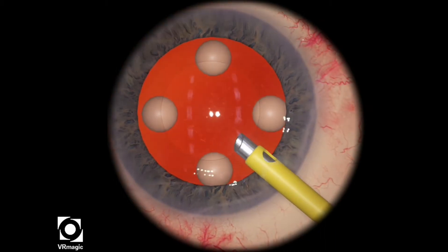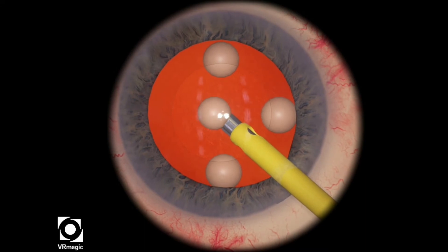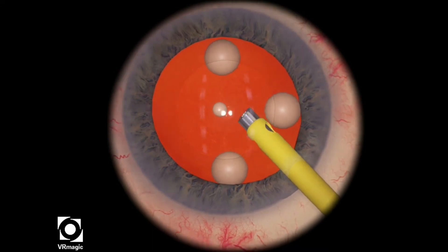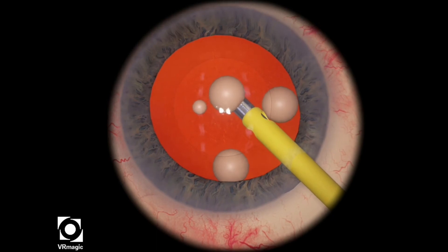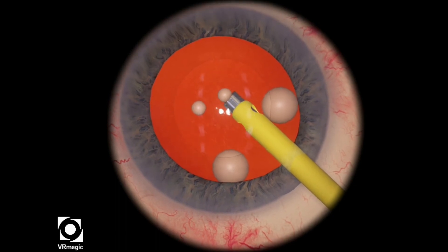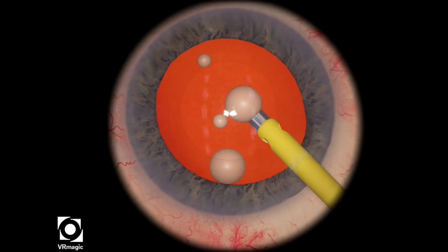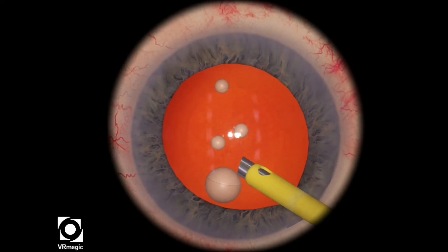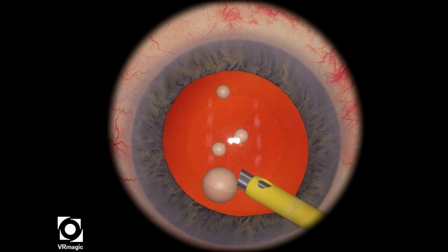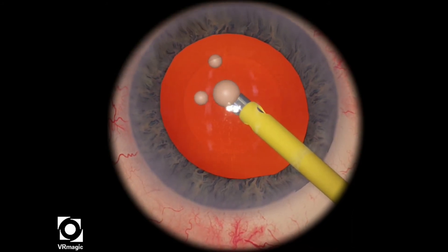This is a very frustrating level because the instructions are very unclear of what you're supposed to do, and it's also inconsistent across some of the other levels as well. For instance, if those balls were supposed to represent a FACO lens piece, if I were just using my regular technique of quadrant removal 1 settings and then taking out the quadrant completely, I would have scored 100, as you can see in some of my other videos.